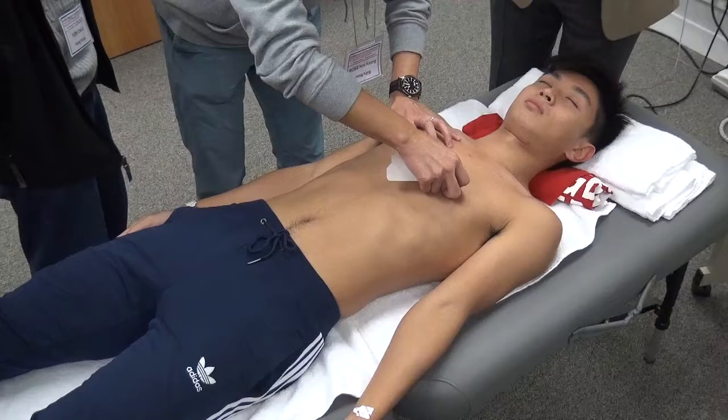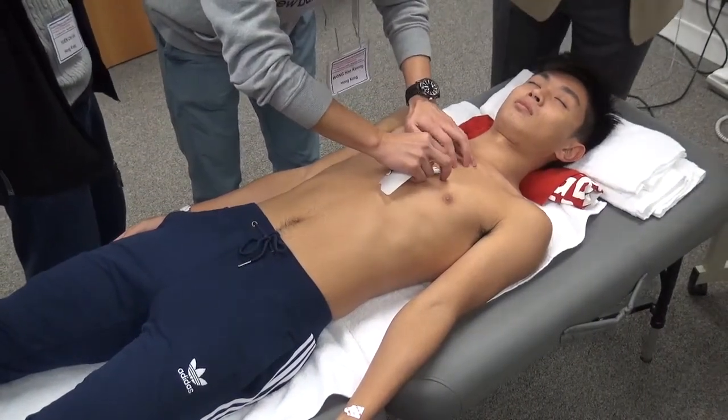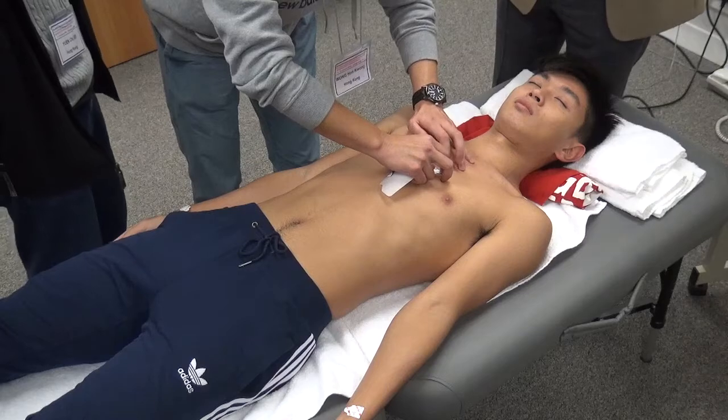Partial right bundle, T-wave inversion, left atrial enlargement, P-wave inversion in V1, all because the leads are too high. You're looking at it going, it's group 2 changes. They're not group 2, it's group 1.